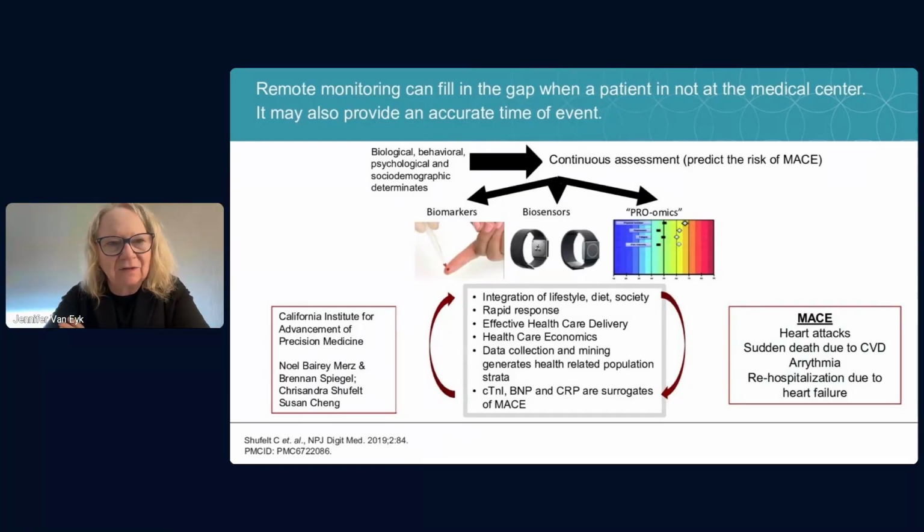The disease that we decided to track, because it was the first time we were going to deploy remote sampling devices, was a kind of highly motivated group. Noelle works with many individuals, but out of her group, we took individuals who had already had a cardiac event. So they are mid-risk individuals. About 20% would have a secondary event within a year. So 15 to 20% would have rehospitalization, arrhythmia, or death, or would have been hospitalized for heart failure. That's called MACE, and we wanted to track these individuals over that time.